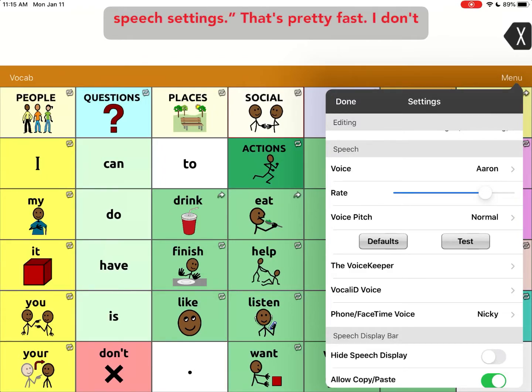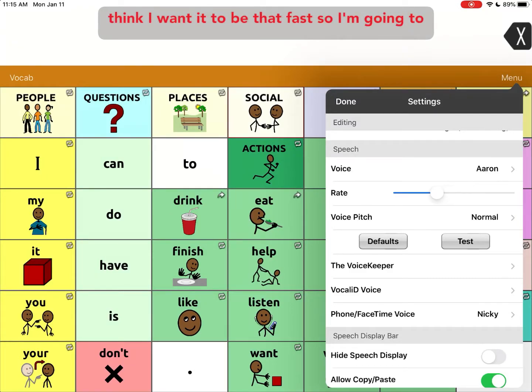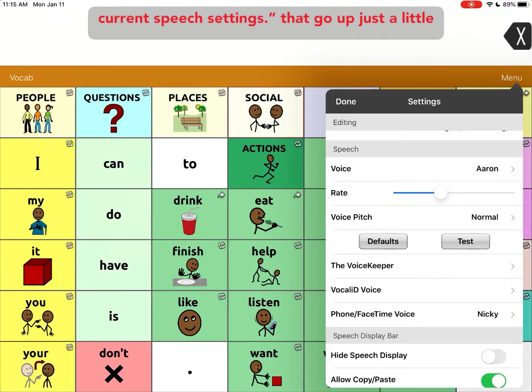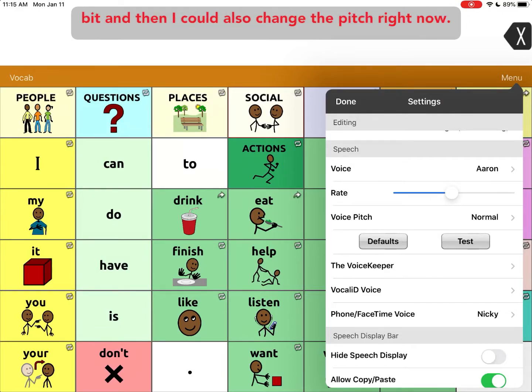Let's test it: 'This is a test of the current speech settings.' That's pretty fast — I don't think I want it that fast. So I'm going to slow it back down. 'This is a test of the current speech settings.' I'm going to go up just a little bit.